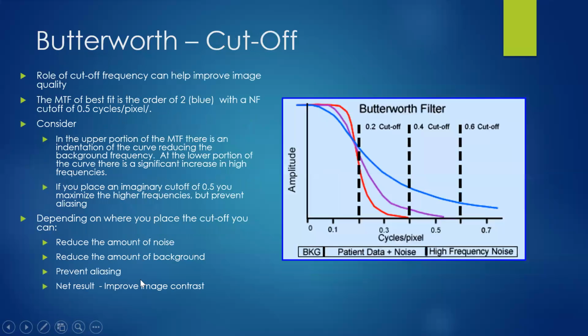So let's bring in cutoff frequency and we'll pull this all together. In Nyquist frequency, let's say this is Nyquist right here, I want to cut this off at this point.